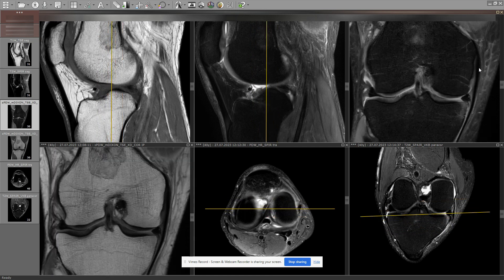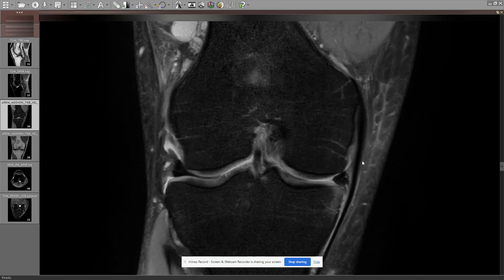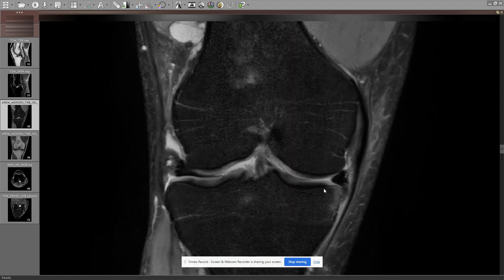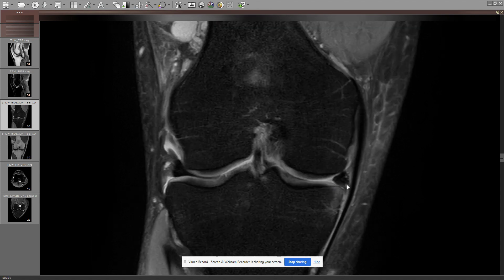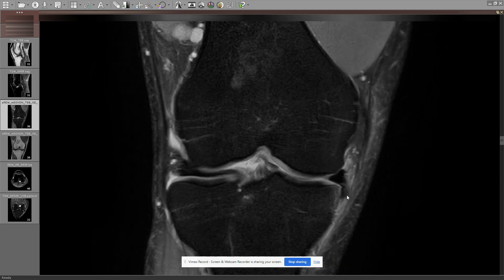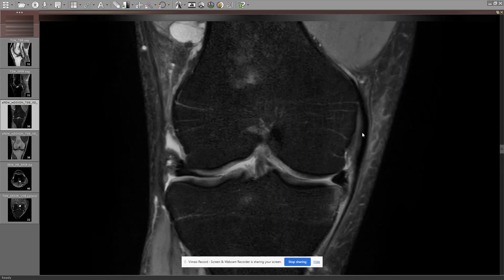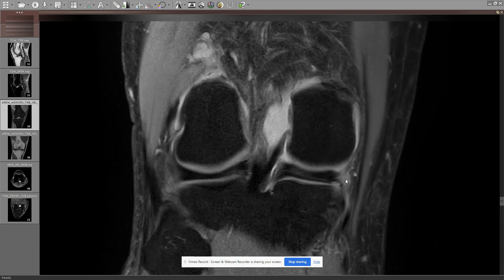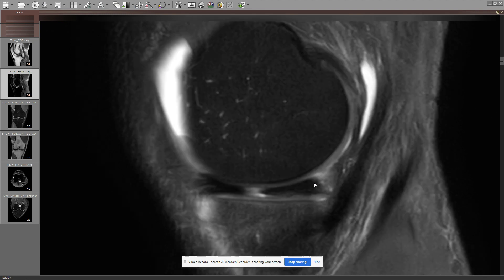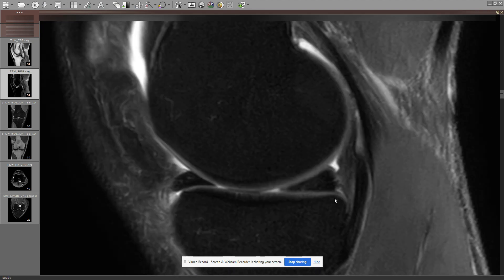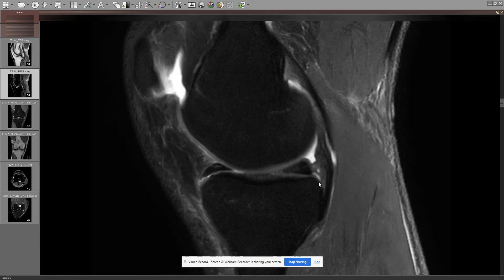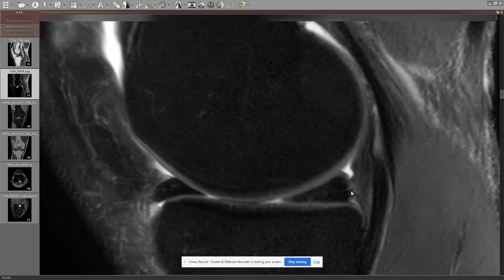Then the medial collateral ligament has a little bit of thickening and irritation around it, which is due to the irritation of all the posterior medial and medial capsular ligament structures — it's just friction and the problem with this displaced flap. Very common finding with thickening, probably after an old injury. We should also have a good look at the meniscus capsular junction. I see just a little bit of edema, but no frank disruption or separation. You can see the meniscotibial ligament coming up nicely, so no separation there.